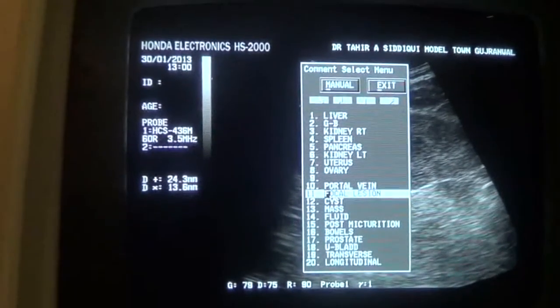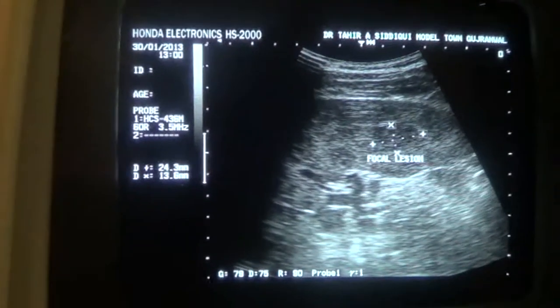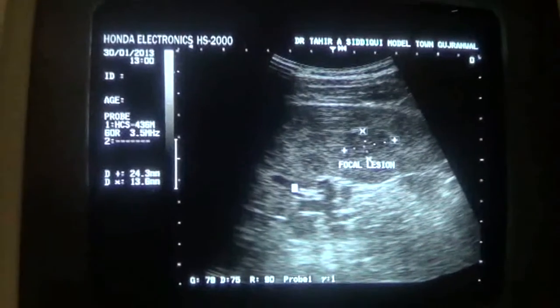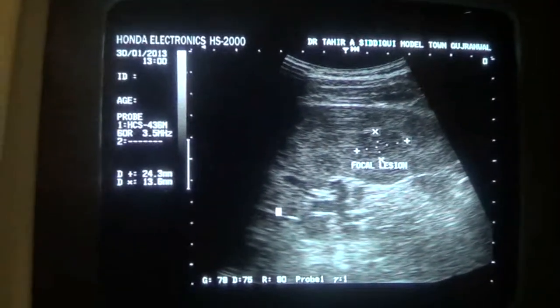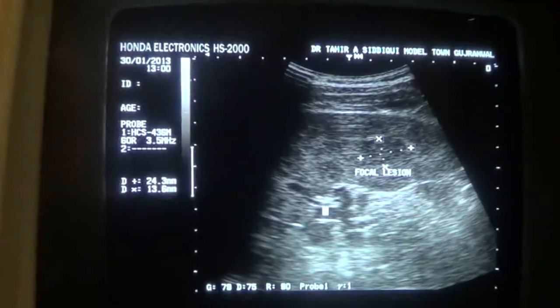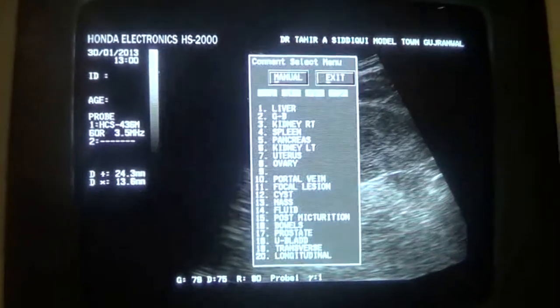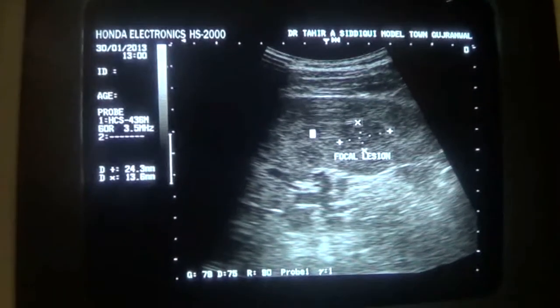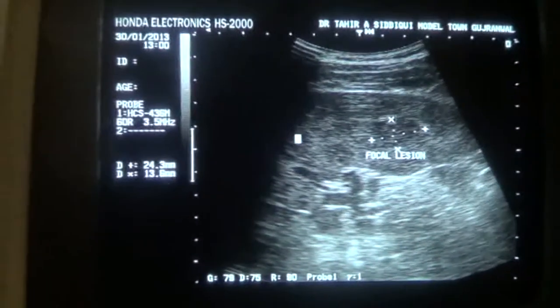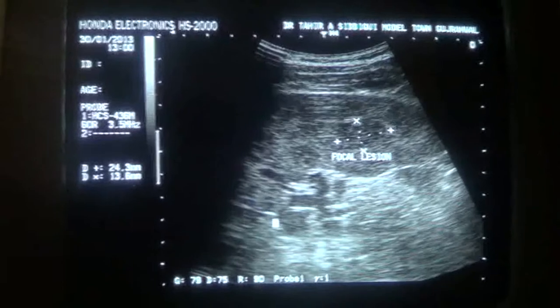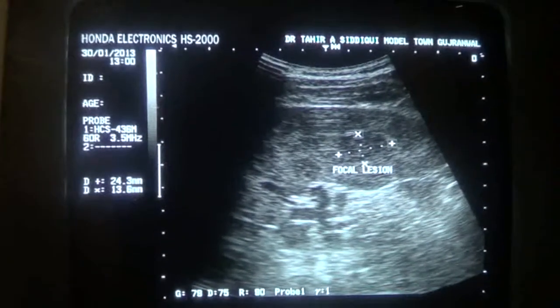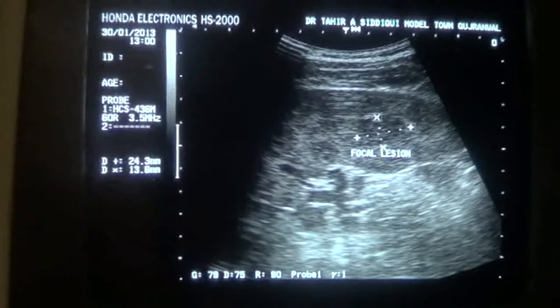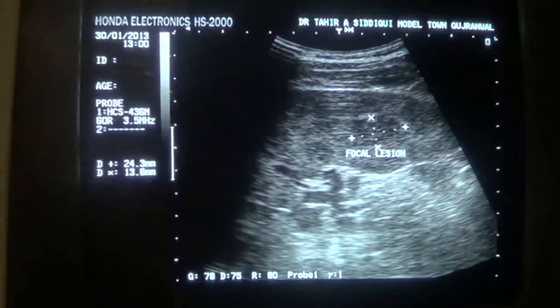Now, this is the focal lesion I am talking about. This is the splenic hilar region, with the splenic vein entering the hilum. And all these are focal lesions — this one, this small one, and these others. So there are multiple focal lesions seen spread throughout the splenic parenchyma.